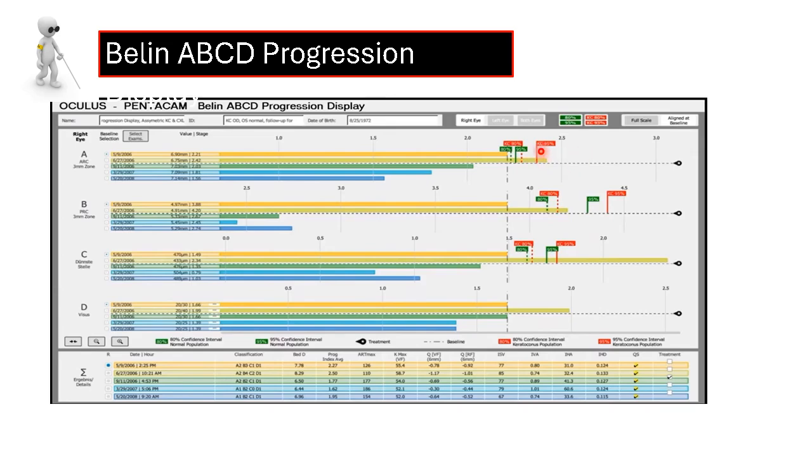Of course, this also takes into consideration the removal of the background noise made by the fluctuation of the tests due to any bias from the sampling, or bias from the doctors, or bias from the machine itself. So the study was done taking into consideration the removal of the background noise, so that you have reliable information for documenting the progression analysis.